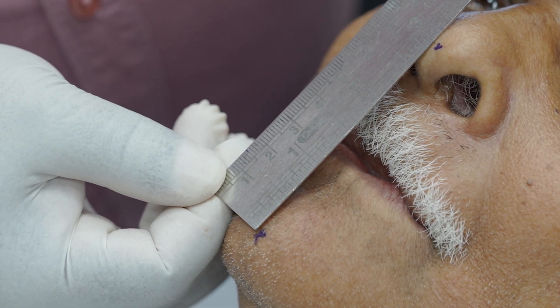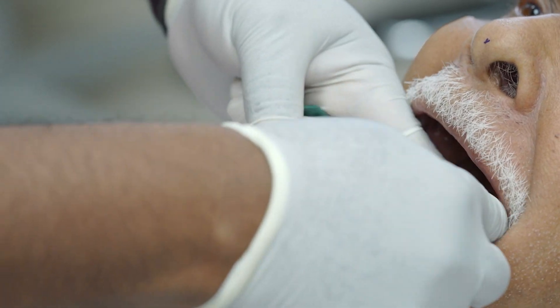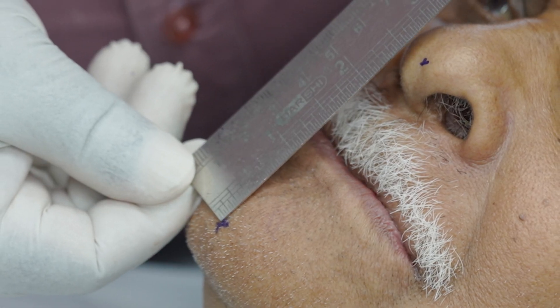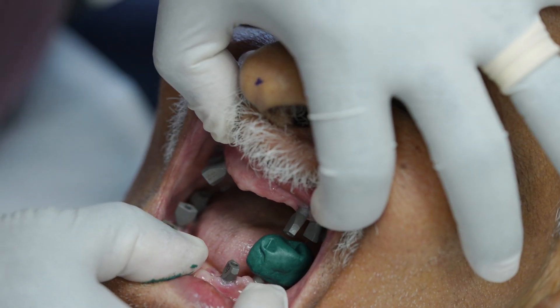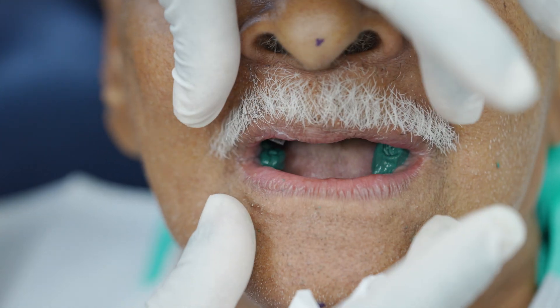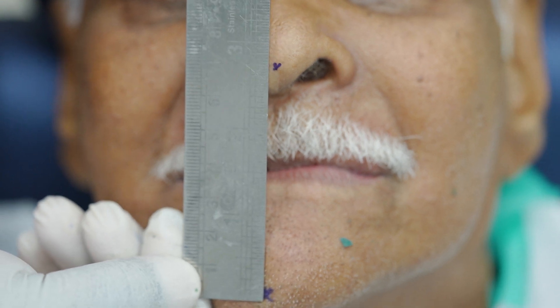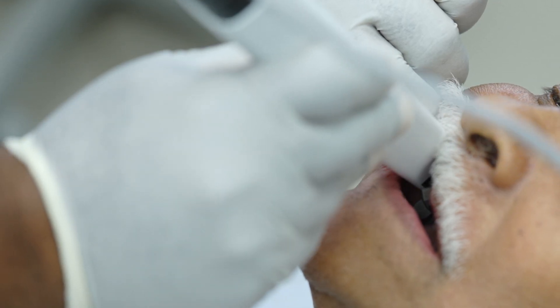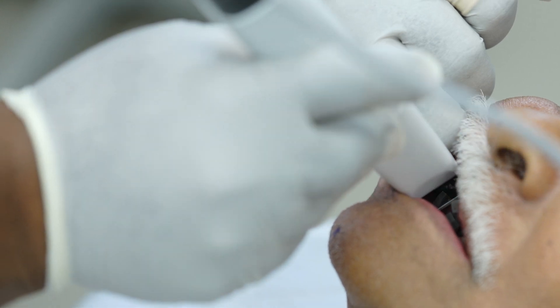Once you have completed scanning both the upper and lower jaws, determine the vertical dimension and create a stop to register the bite in the required vertical dimension, as it is a completely edentulous case. In this case we use low fusing impression compound to make stops on both sides to record the bite. Keep these stops in place and scan the bite on both sides.